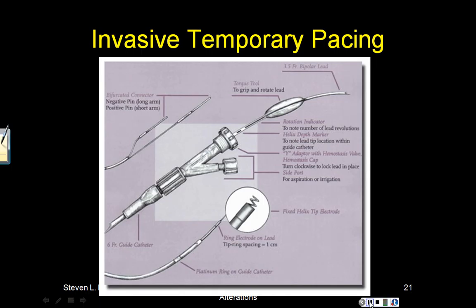What we hope is that this catheter will remain in contact with the cardiac muscle and actually stimulate the muscle to contract. Now, this works much better than transcutaneous pacing. It takes much less electricity. It is not painful to the patient in most cases. They do not feel this. The biggest problem is that it is an invasive type procedure.